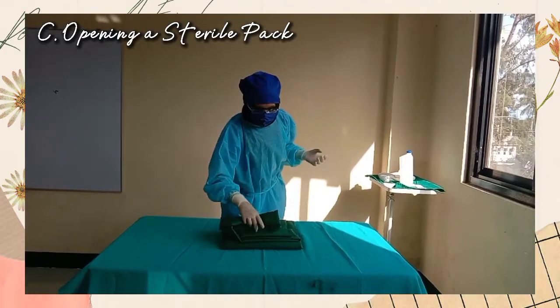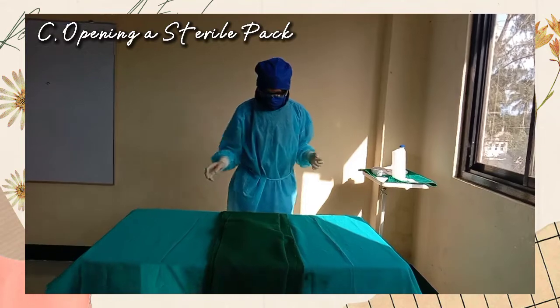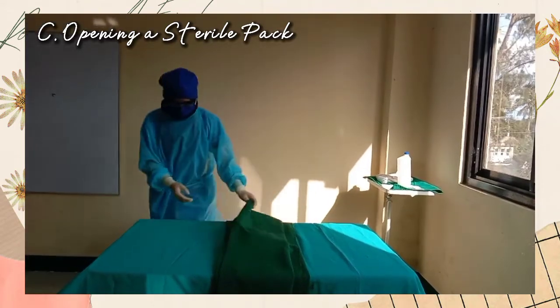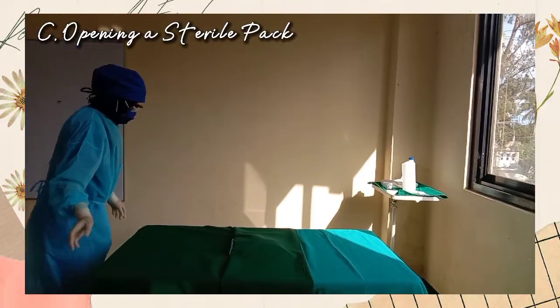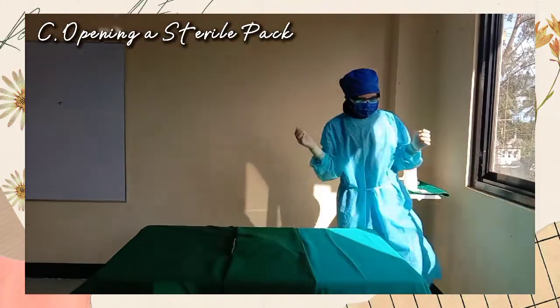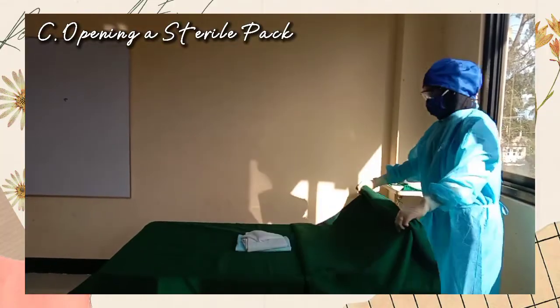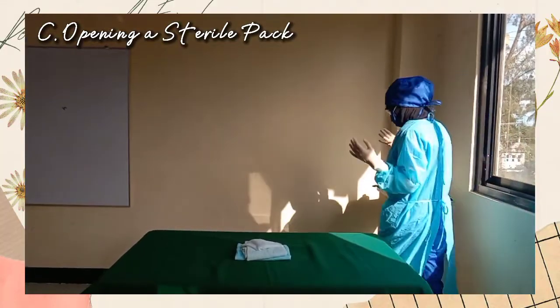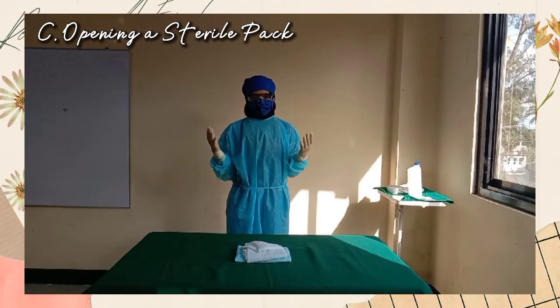Side flaps are opened one at a time. Opening the top one first, use the right hand for the right flap and the left hand for the left flap. To watch each flap being opened lowers the risk of contamination. Pull the fourth flap towards you by grasping the corner that is turned down. Make sure that the flap does not touch your uniform. If the inner surface touches any unsterile article, it will be contaminated.